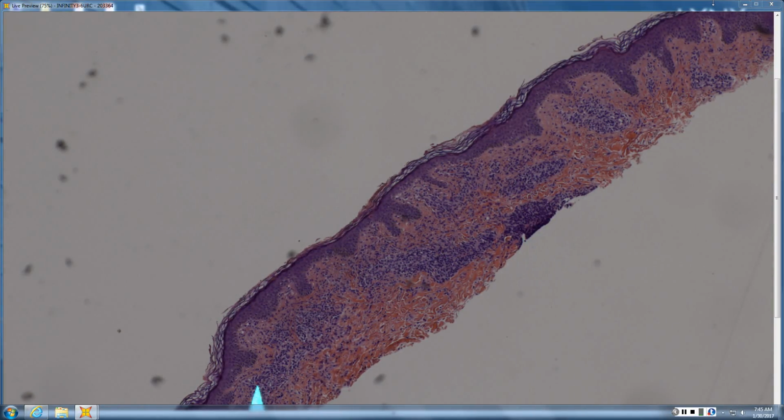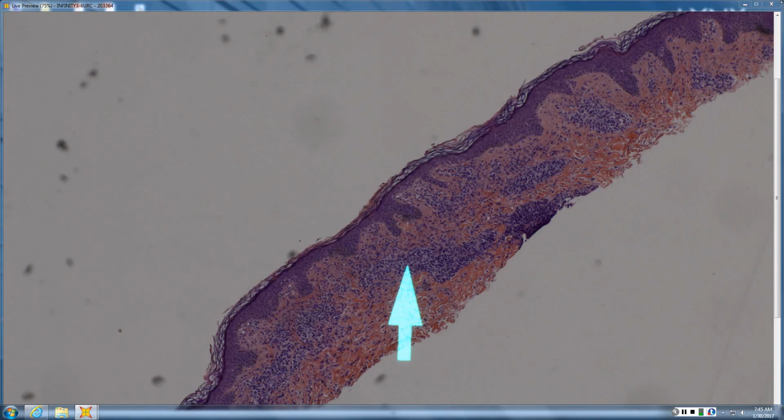From here, maybe vessels, but maybe I can't really see vessel lumens. You're kind of questioning because you don't see vessel lumens. So it kind of looks like that ought to be perivascular, but there's no vessel lumen. Anything that you know of that characteristically gives you a perivascular infiltrate in the absence of a vessel lumen?